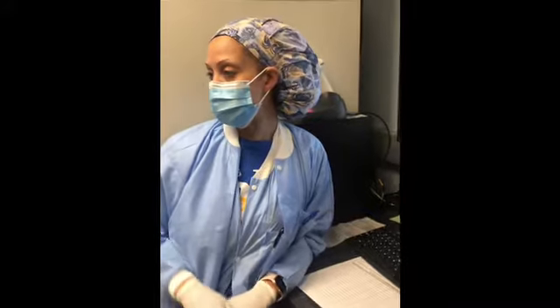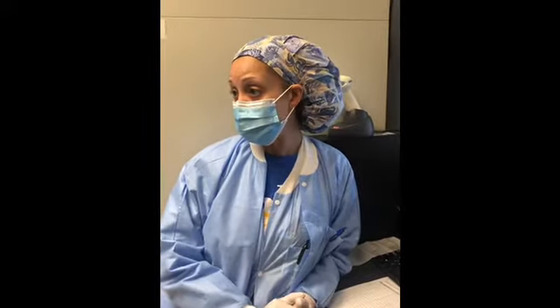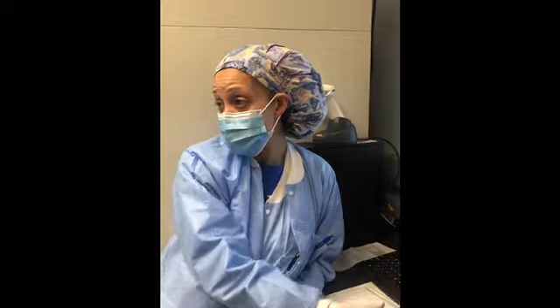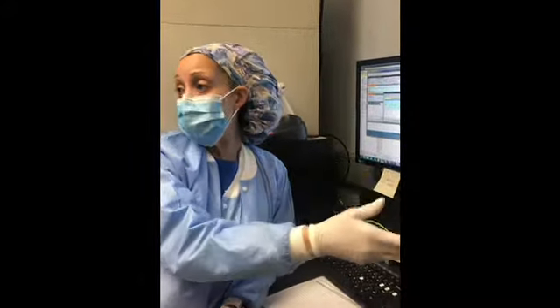So we just kind of do a little background. Before you repeat it, first thing I would do is check to see if the patient has been transfused with maybe 2 or 3 O-neg units recently. That'll be your first thing to check. If that is the case, then that's your justification to go ahead and allow it to cross over, and you just have to put your own interpretation in, and you will put AB positive in there, but you're gonna have to override it all the way through.